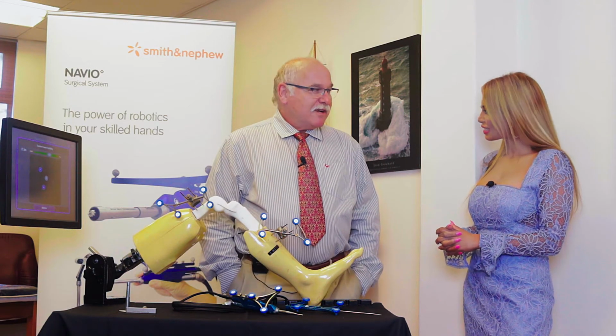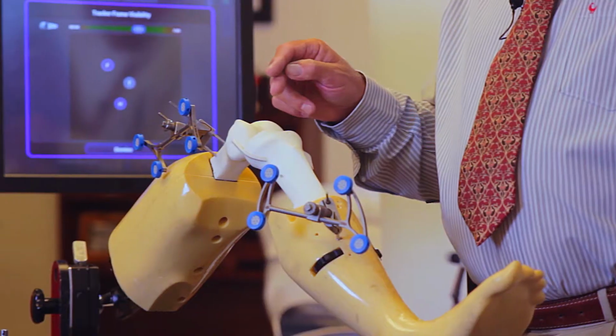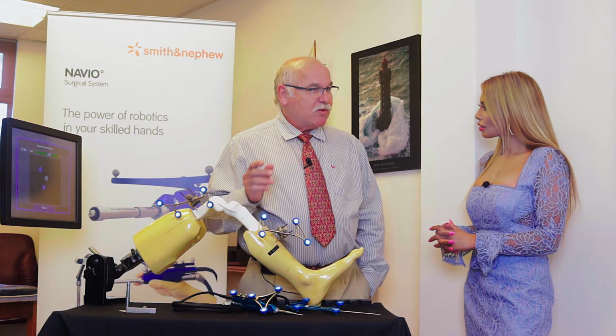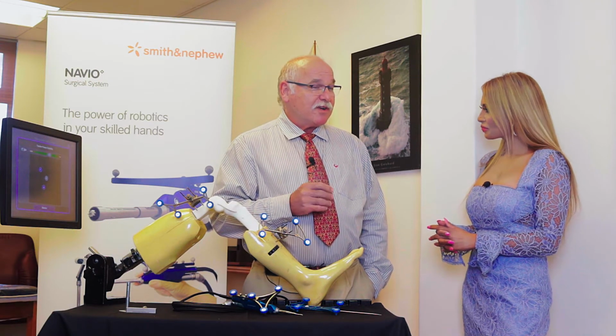Well, in orthopedics specifically, it has enhanced a lot of things for us. First we must start with the challenges of knee replacements, or knee arthroplasty. In knee arthroplasty, there's big patient variability, a great variability in the size and the position of the femur, and a variability in the joint line. To accommodate all these variances with one single recipe, you can run into dissatisfaction. So in knee replacement arthroplasty there is satisfaction of 80% of patients, but 20%, if you ask nicely, aren't actually very satisfied with their knee replacements.